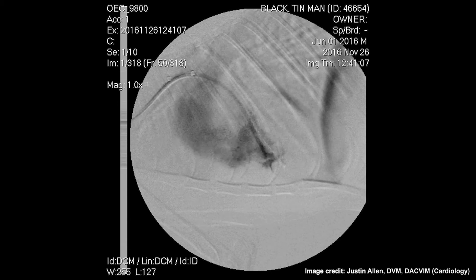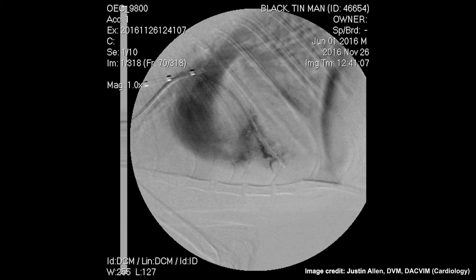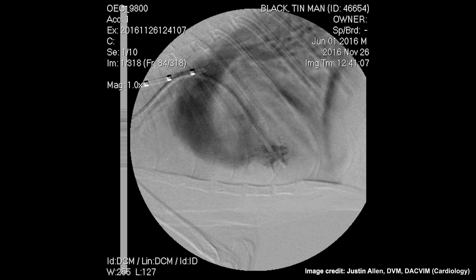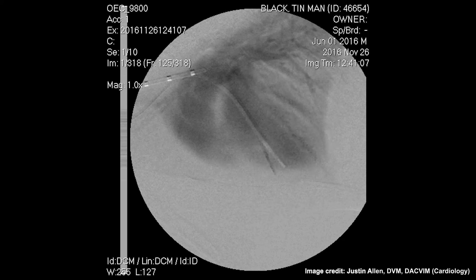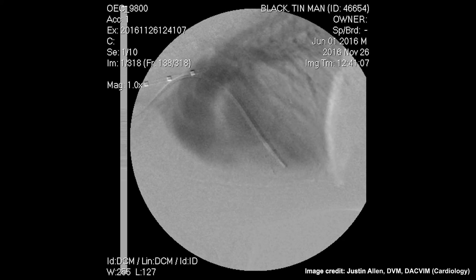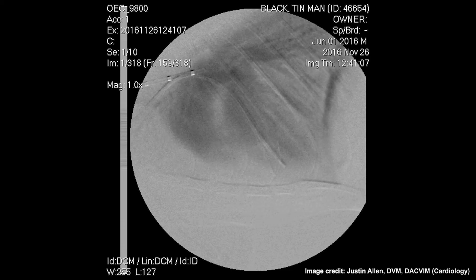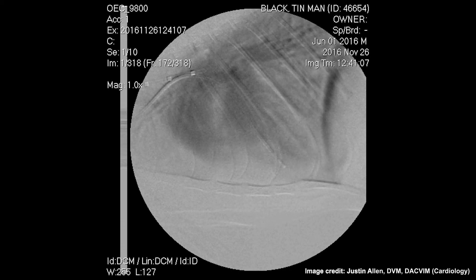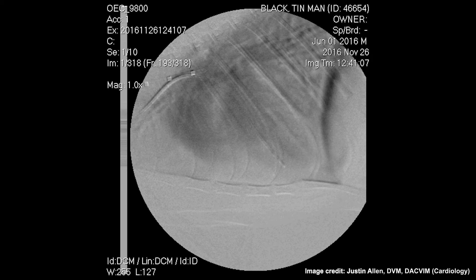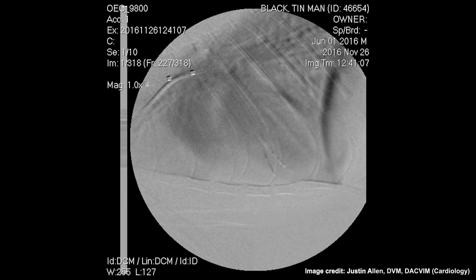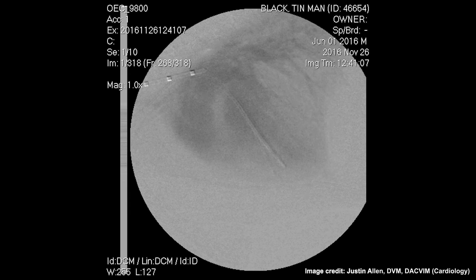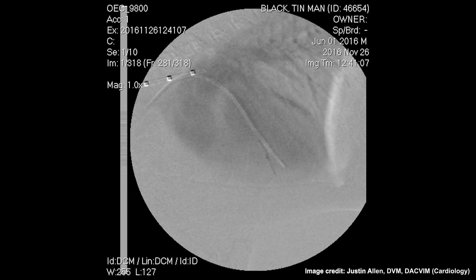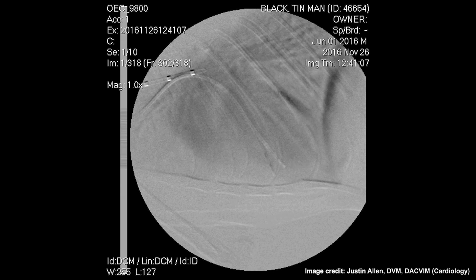This angiogram confirms the presence of a ventricular septal defect. We can see that a large portion of the contrast is shunted back to the right ventricle. This causes over-circulation of blood within arteries and veins in the lungs. We can clearly see the dilation of the pulmonary trunk because of the over-circulation effect. As you can see, the heart became an ineffective pump with so much blood shunting from the left side back to the right side of the heart.